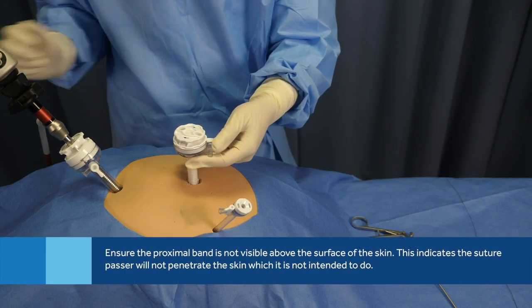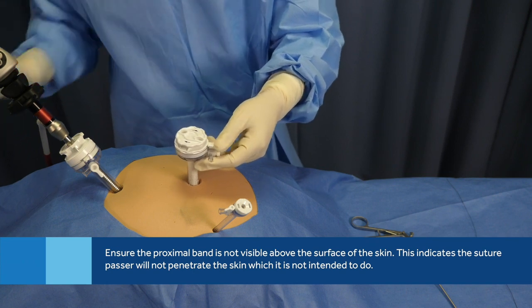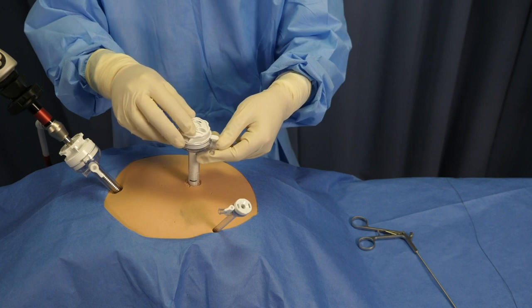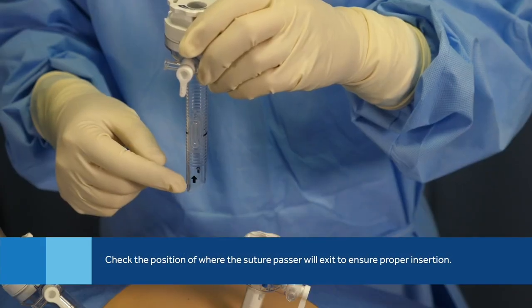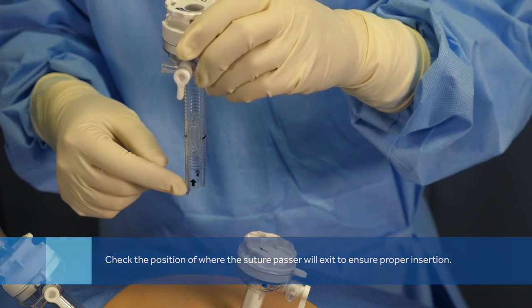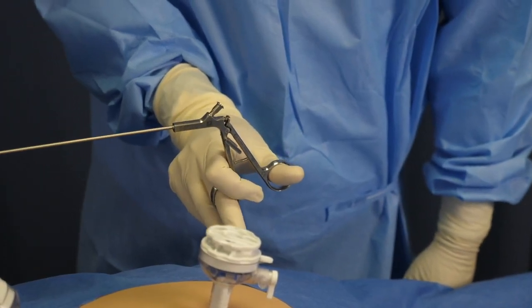Hold the cannula at 90 degrees to the tissue and ensure the distal black band on the cannula is aligned with the peritoneum and the proximal black band is below the skin. The black arrow indicates where the suture passer exits the trocar.